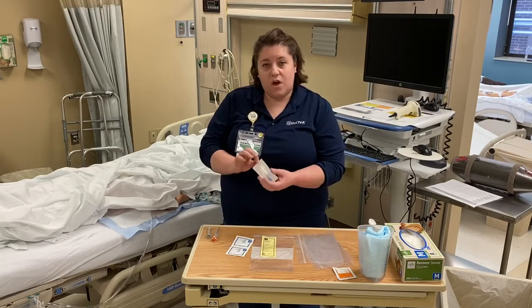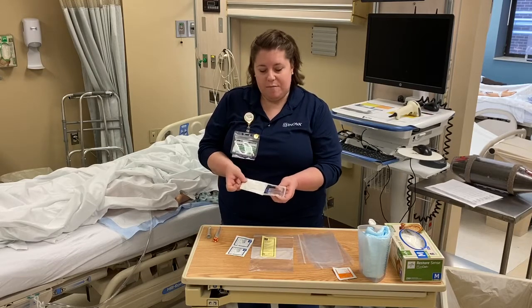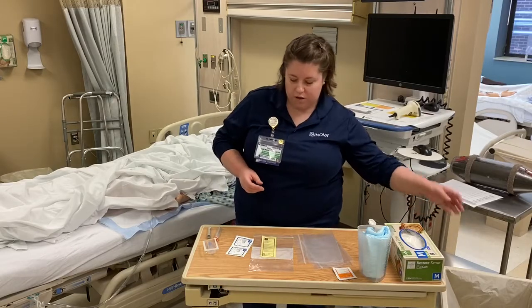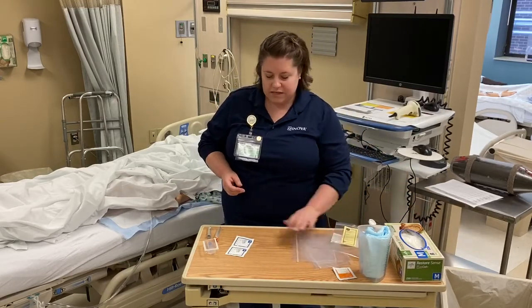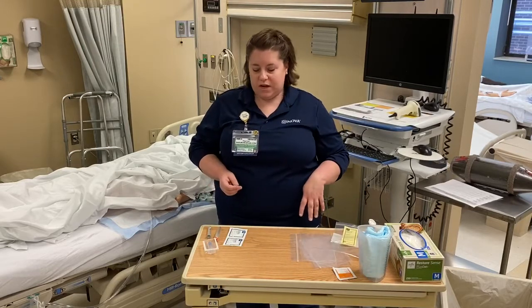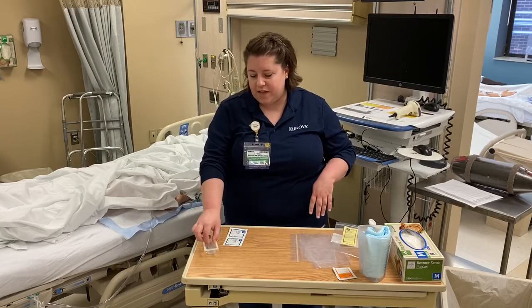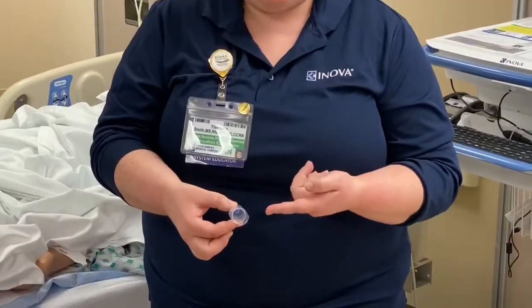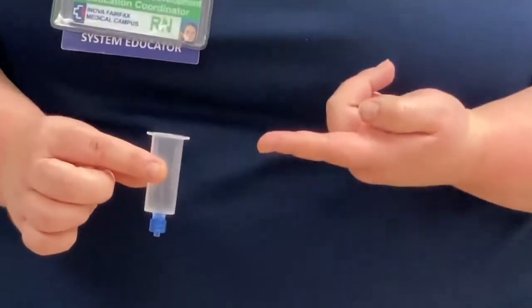I'm also going to open my transfer device. I leave it in the package, but just take the paper off so that it's ready to go, and I will throw that away. I can move my bag out of the space, and I have my alcohol tubes ready to go. Something I want you to keep in mind about this transfer device is there's actually a needle inside of it. So this gray rubber colored thing is a needle. So just be careful, don't stick your finger inside of it, okay?